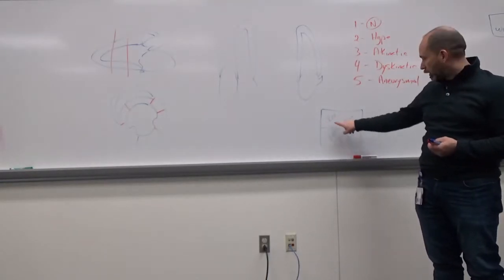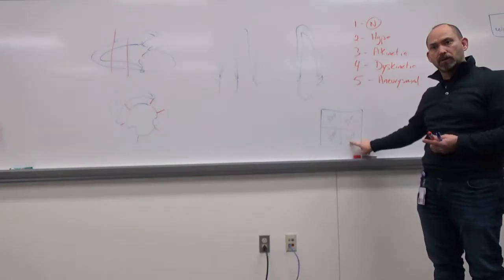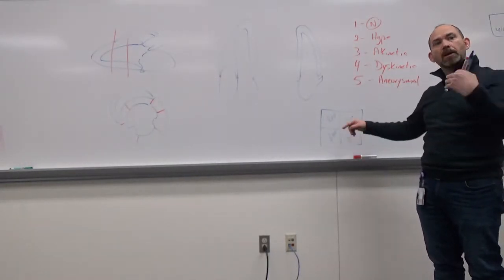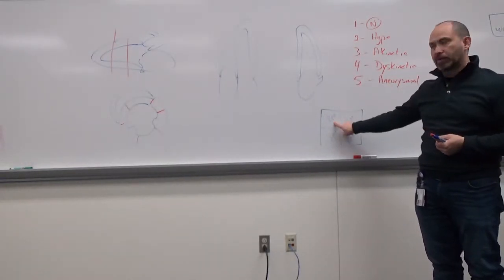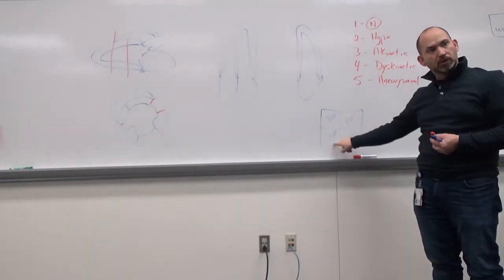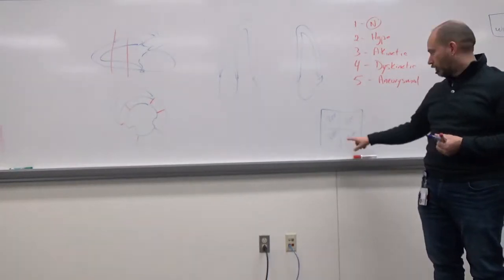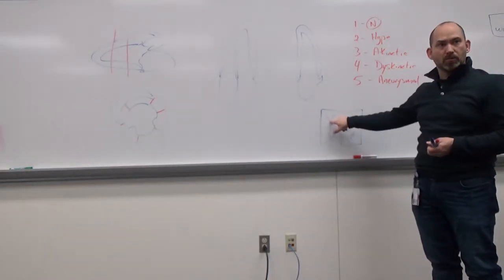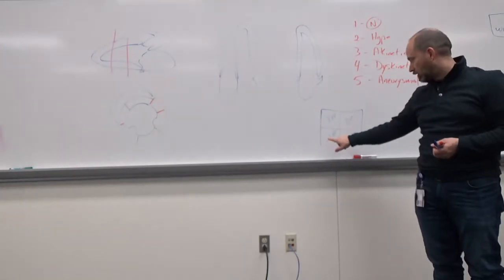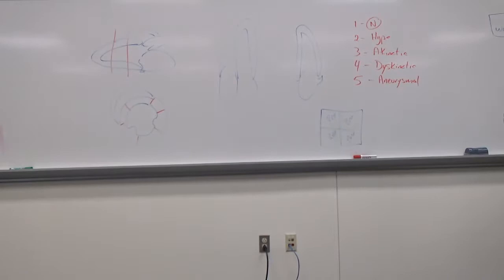And in that case, I have parasternal long axis here, short axis here, 4 there, and 2 here in rest. Post-stress, it splits them out, so I have long axis at rest and long axis post. I'll have my short axis at rest, short axis post. And then the next frame is going to be another set of 4 images with 4-chamber rest and post and 2-chamber rest and post. Okay, so the resting is always on the left side.